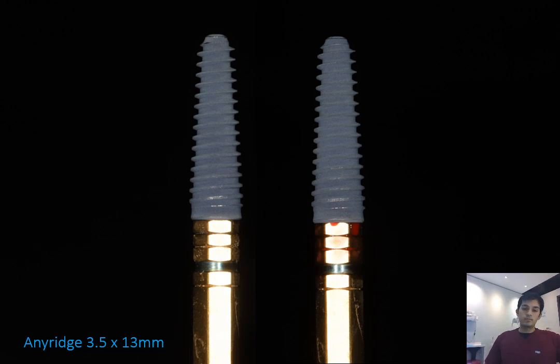The implants we had planned to place here were 3.5 millimeter in diameter and 13 millimeter length. Now, to place the 3.5 millimeter AnyRidge implant, you only need a couple of drills, working with a core diameter of 2.8. It's just your 2 millimeter twist, and I normally drill up to at least what the core diameter was, in this case 2.8. So just 2 drills through the guide. Doesn't take long. The guide ensures that you're not moving around too much and corrects angulations. Again, in keeping your chair time to a minimum, keeping the appointment short, the guide really helps with that.